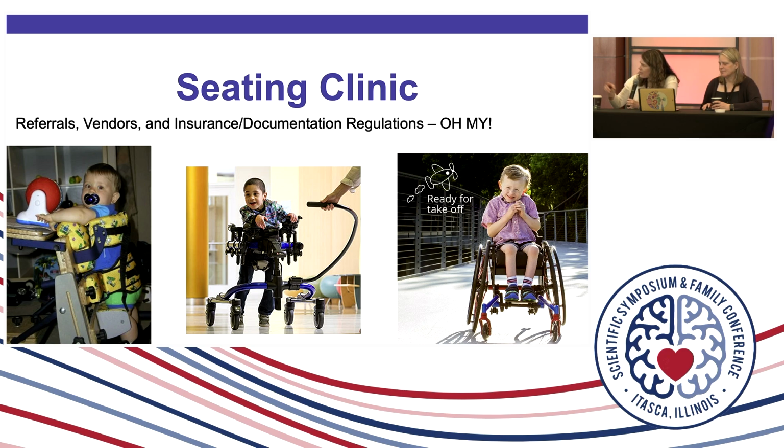So on the left is a child in a standing table, which allows them to bear weight and participate in standing even when they are unable to do it independently. The middle picture is showing a gait trainer that provides a lot of stability to allow the child to be upright and mobile, but with safety safeguards and support. And then on the right side is a wheelchair that fits a child well, really allowing them the independence to be able to participate in activities.